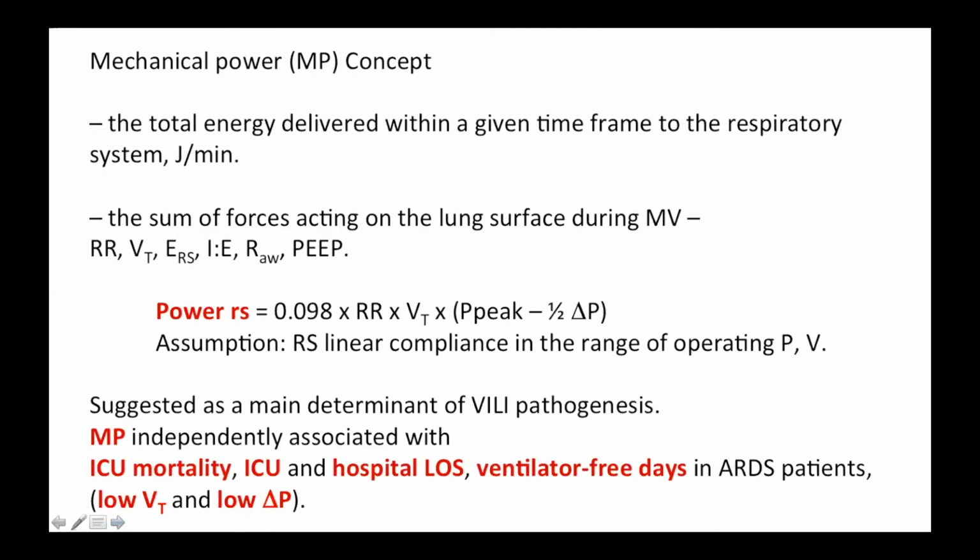So in the concept of mechanical power, I note that this means we are very concerned with the total energy delivered within a given time frame to the respiratory system, joules per minute. And we are also aware that the sum of forces which act on the lung surface during mechanical ventilation have been always defined by us.